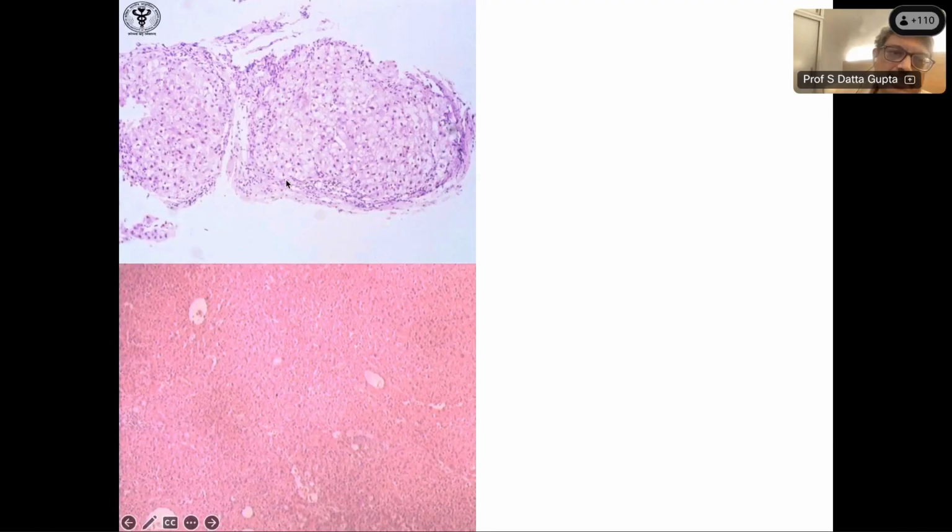This looks like a cirrhosis, but not complete. It's not seen here. This also might be cirrhosis. You're not sure whether it is fragmented or not. And this one is a case of portal hypertension. Does it look normal or abnormal, this one? What do you think this is? Let's go to this. What are the votes for this?